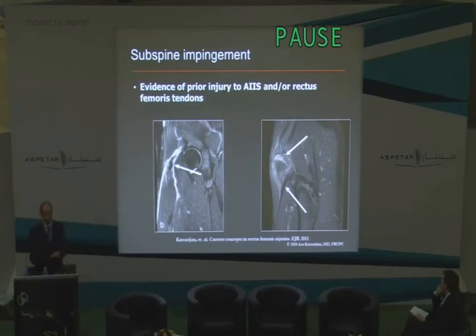And as you have injuries of these, in the younger children, you have apophyseal avulsions, as we see in this sagittal fat-suppressed proton density image. This is the anterior-inferior iliac spine. This is a big chunk of bone that has been pulled off. The direct head is somewhere in here. In this case, the indirect head remained intact. In other cases, you have actually avulsion of both tendons, and then you can either just have tendon avulsion and ossification, or you have apophyseal avulsion and ossification.